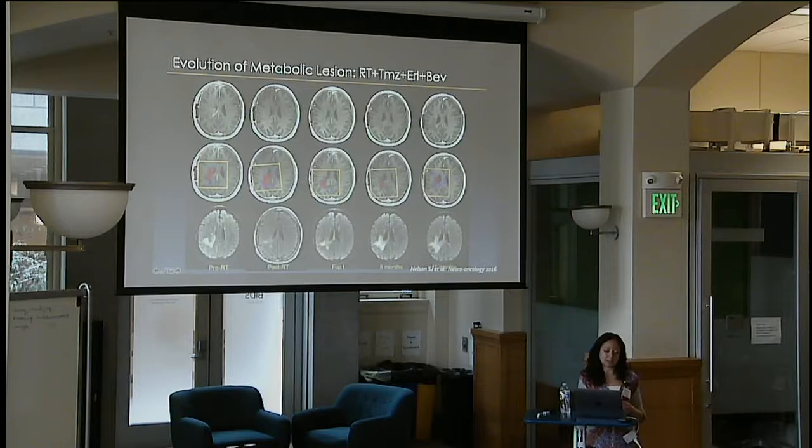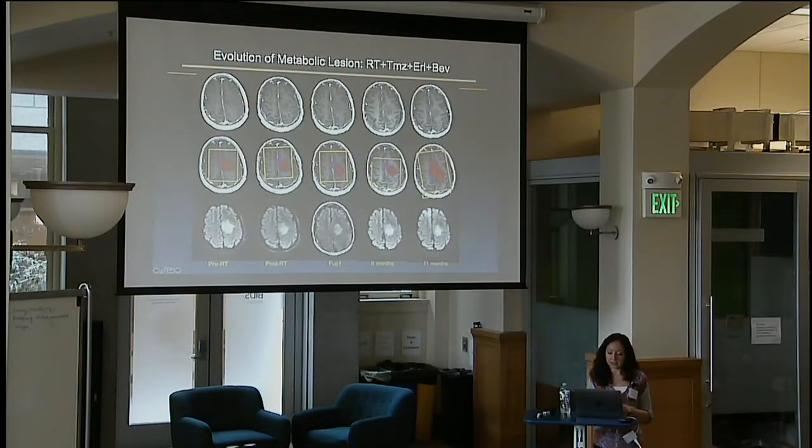And then this is an example of your metabolic CNI map that I explained before, where this can be used to maybe increase your specificity in these challenging cases, because this bottom row where the T2 lesion appears to actually get bigger over time, but the metabolic lesion is shrinking. Or conversely, you have a region of T2 lesion that seems like it's stable and the person would be doing fine from this, but then your metabolic lesion is actually growing at this point.